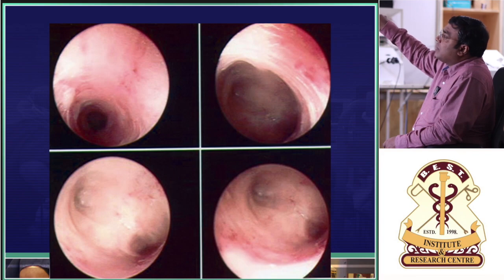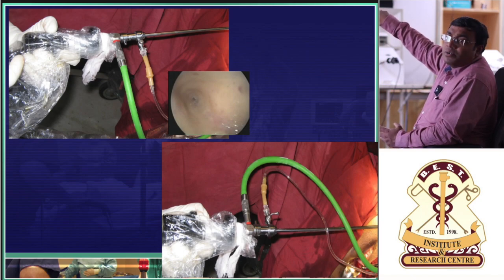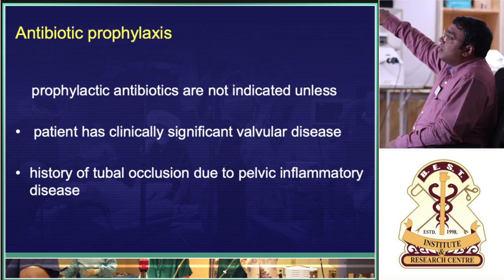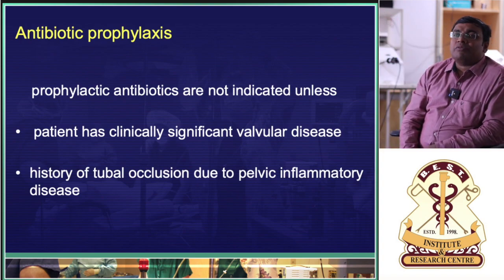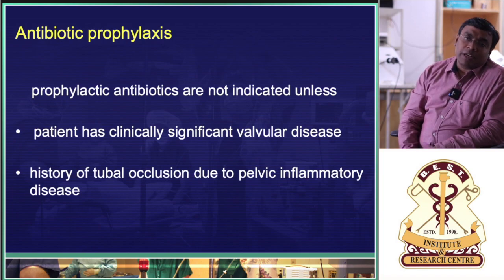So this is how it looks on the inside. This I am not going to tell again because it's already been dealt. So antibiotics generally we don't give, but at the max what we follow is one dose of third generation cephalosporins, 1.5 gram IV, half an hour prior to induction.